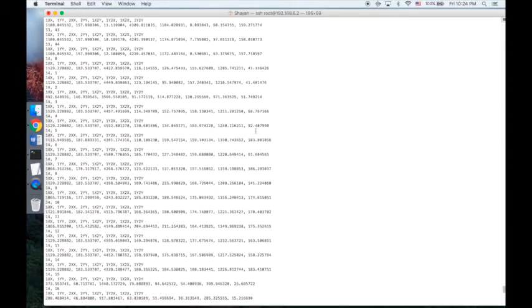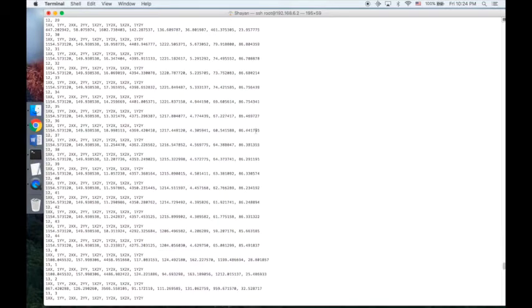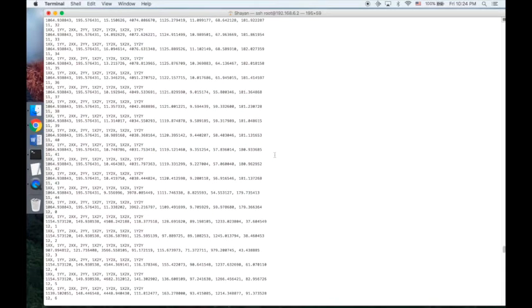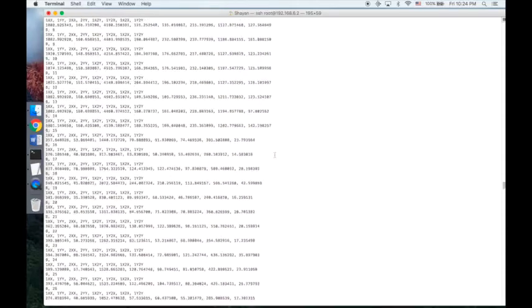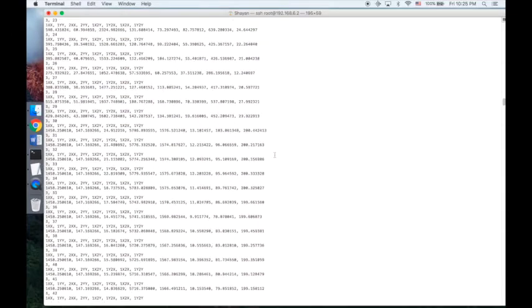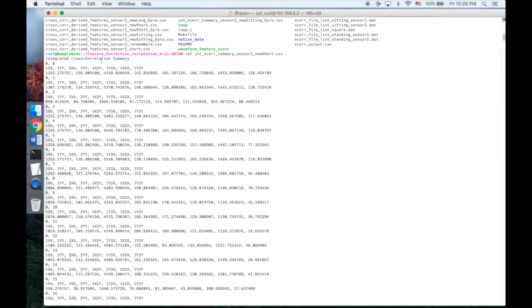Now we performed the feature extraction for all of our lists for two important axes of motion, and one of them was to perform features for axis Y versus axis Z, and that means for the acceleration Y and acceleration Z columns. And the other one was to perform the feature extraction for acceleration Z versus gyrometer Z. Now this shows the integrated cross-correlation summary for sensor 1 for the short type of motion, and this corresponds to acceleration Y versus acceleration Z.